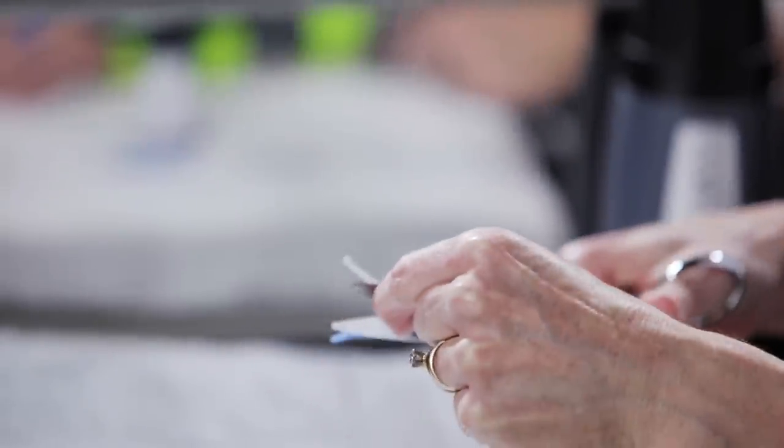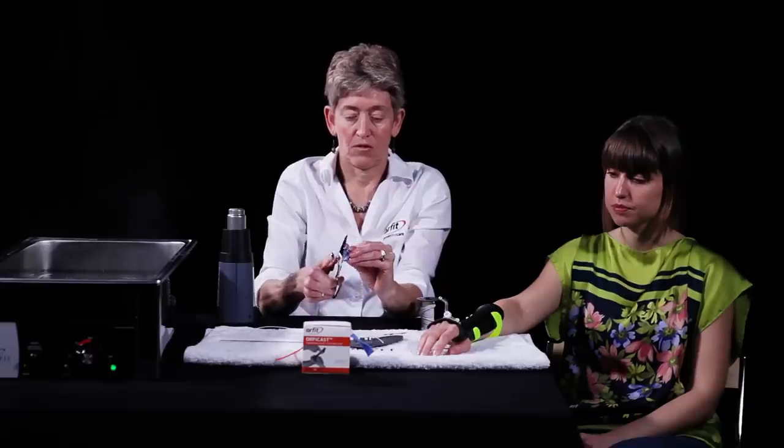Trim the finger cuff, rounding the edges. Attach the elastic threads to the finger cuff by dry heating each briefly and bonding together.